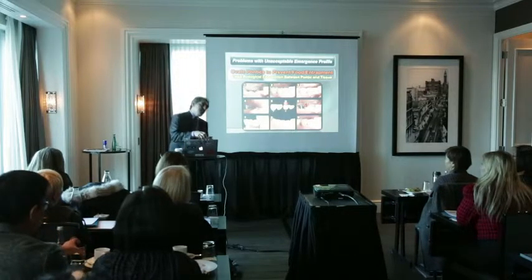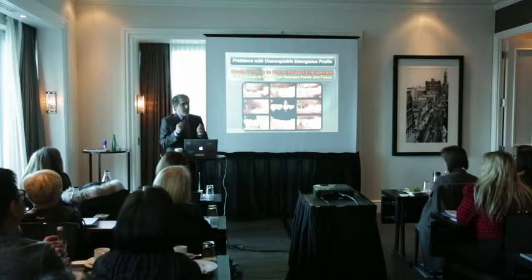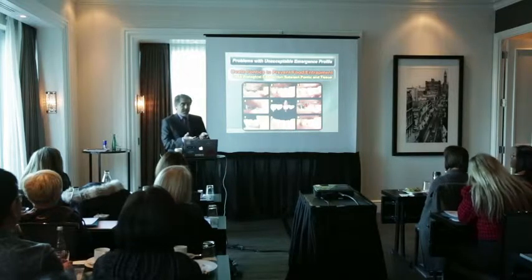So when you remove this pontic, you will see that the tissue is quite red. This is because of the very weak biological contact between the two, and there is some sort of attachment. This attachment is important. So as much as possible, it's better to develop a convex surface which is in direct contact with the base of the tissue.